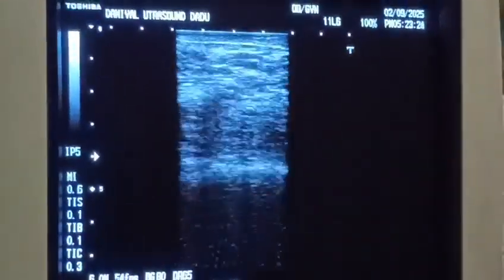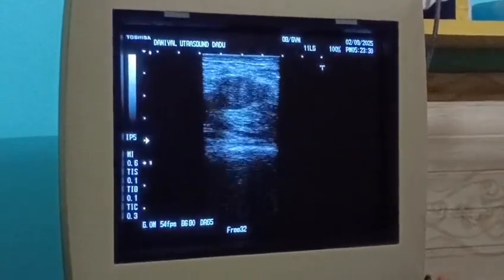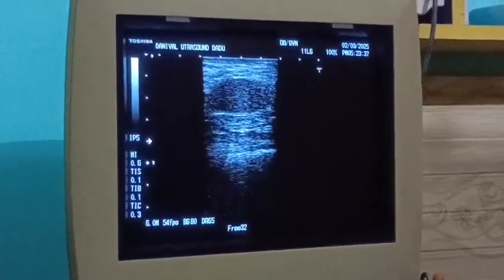Here we have got this interesting topic. The patient with complaint of swelling in the left scrotal area sent by a physician. Now let us see what is going to be disclosed.